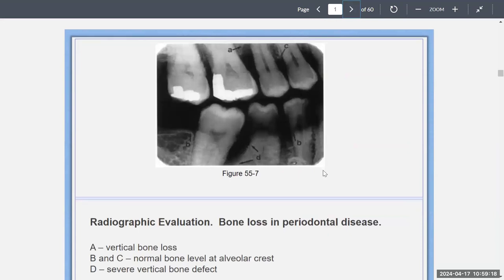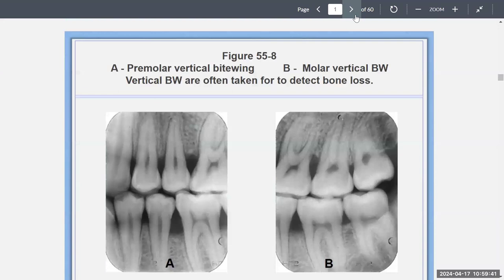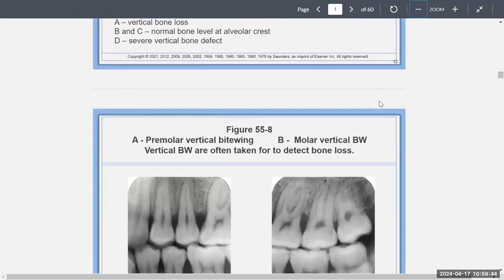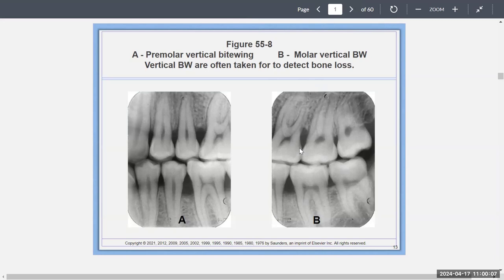You also want to consider your radiographic evaluation — looking at bone loss in periodontal disease. You want to see vertical bone loss, as shown in image A, and then normal bone level at the alveolar crest in B and C, and a severe vertical bone defect in D. Vertical bitewings are used — premolar and molar vertical bitewings — because horizontal bitewings may cause you to miss how much bone loss there is. Many dental hygienists take vertical bitewings to make sure they capture the full extent of bone loss.